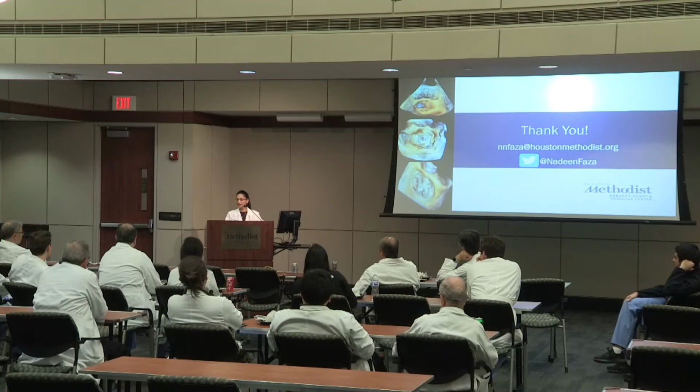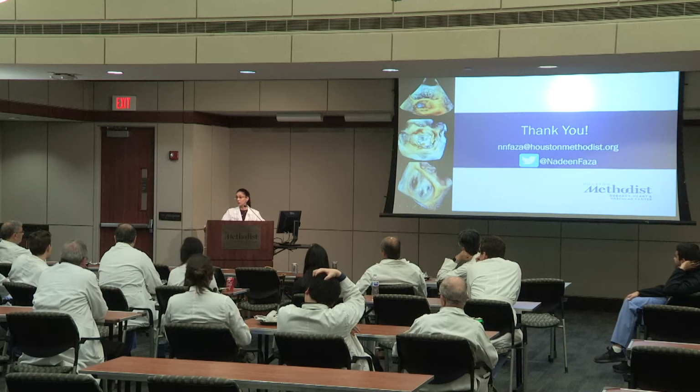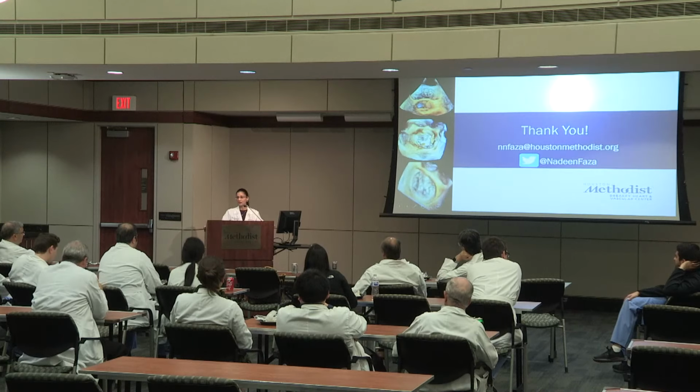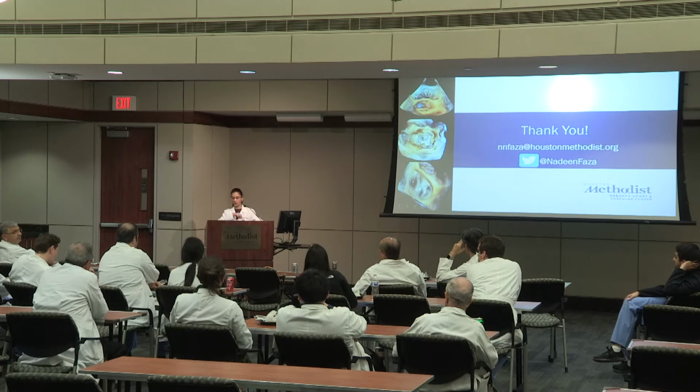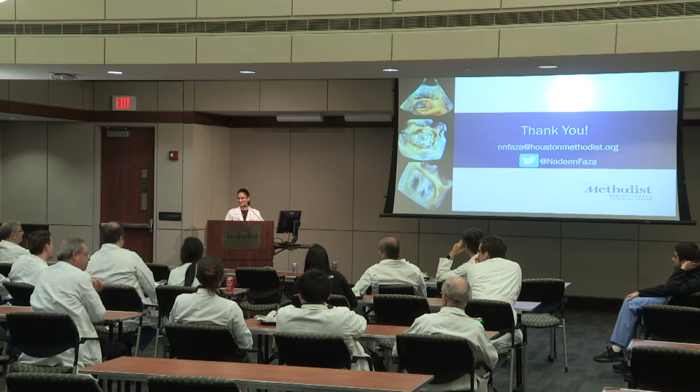It's been okay. Again, the use of 3D, I'm alive. No, it's for the imagers to do. We monitor them monthly, and honestly, when you're heavily relying on 3D and 2D echo guidance, the amount of fluoroscopy you need decreases significantly. Where do you place the badge on your neck? Or no, here in the pocket, front pocket. Because you probably want to get it as close to the radiation source as possible.